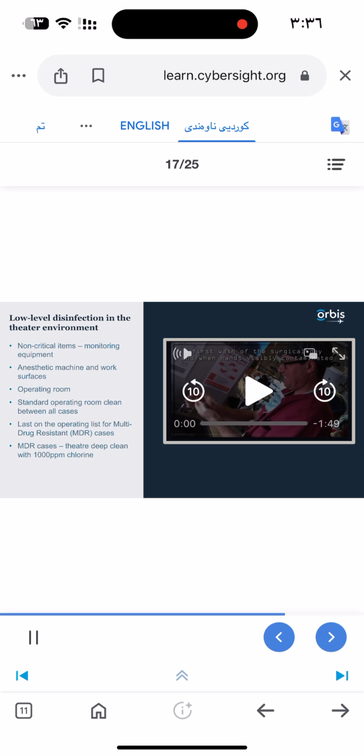In the video here you will see hand washing taking place. You will see use of a receptacle for soiled airway equipment, and also at the end of a case and between cases a low-level disinfection of the non-critical items.